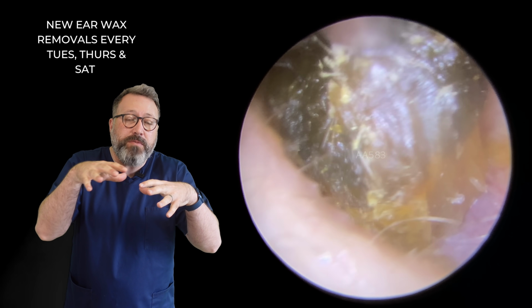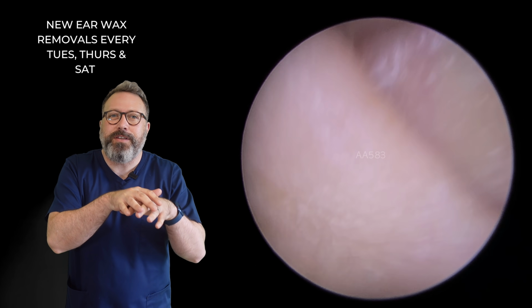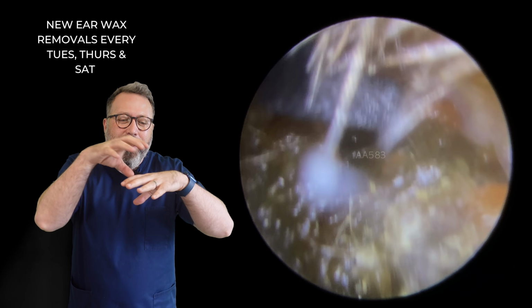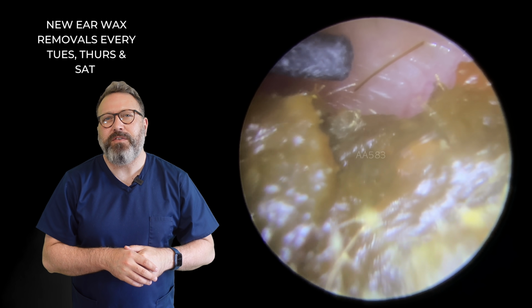So as the wax is trying to migrate out, because we know that wax tries to migrate out all the time, when it gets to the entrance to the canal, if you've got these little kind of dry skin lifts, it'll hold on to those. So we're going to bring the St. Bart's hook in here. We're just going to see if we can sneak over the top.